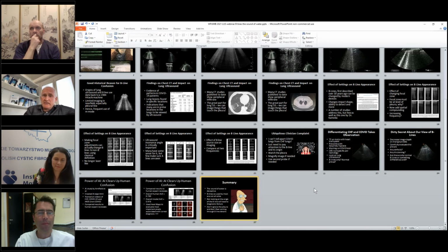Yeah, so at the point of care, the clinician should do the examination with a certain question to be answered and a symptom, dyspnea, to be solved. And whenever we have a specific peripherally located tumor or a lesion to be biopsied, it's a very special pneumological or oncological question. It might be in a certain and different setting.